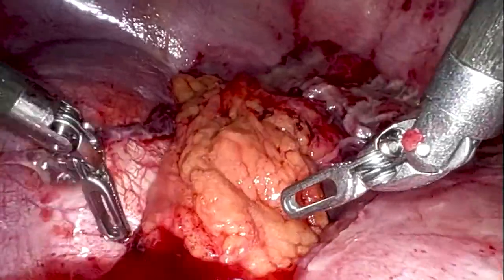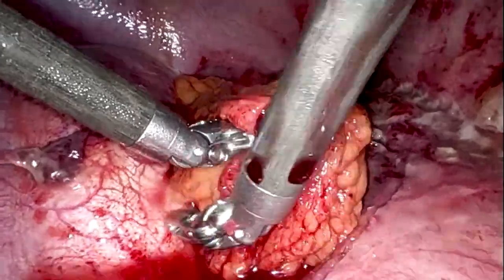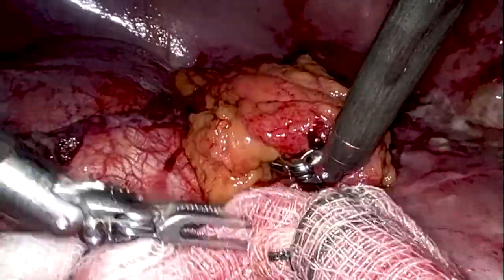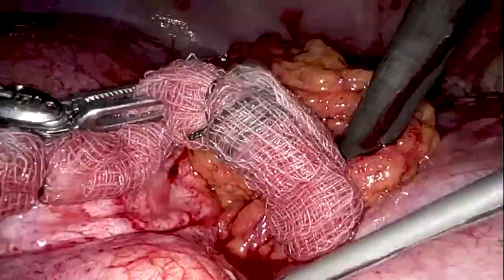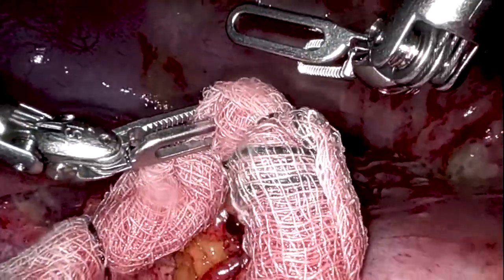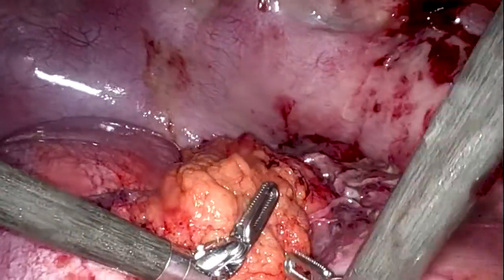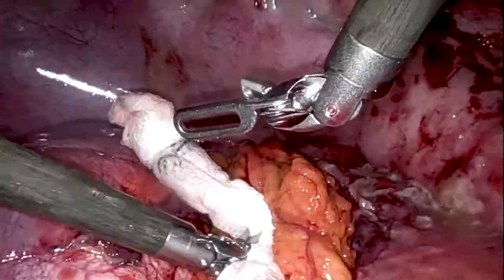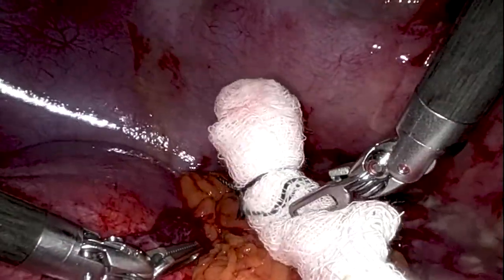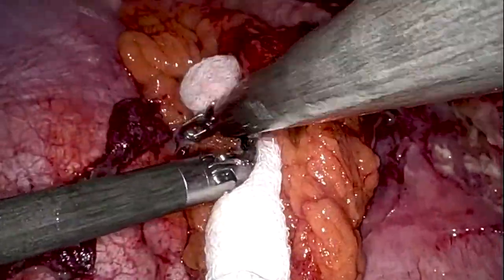In this sped-up view you can see the diaphragm on the left and the pericardium and heart beating quickly on the right. The assistant is placing cigar swabs — swabs rolled up by the scrub nurse — which are useful because, unlike the trumpet sucker, they don't deflate the diaphragm by removing CO2. The cigar swabs dab up remaining blood, and no major bleeding is expected for the rest of the operation.